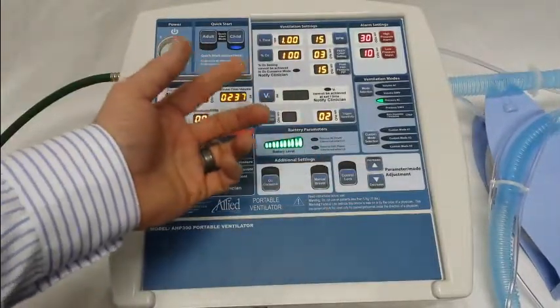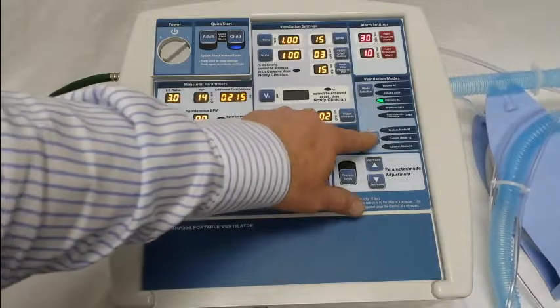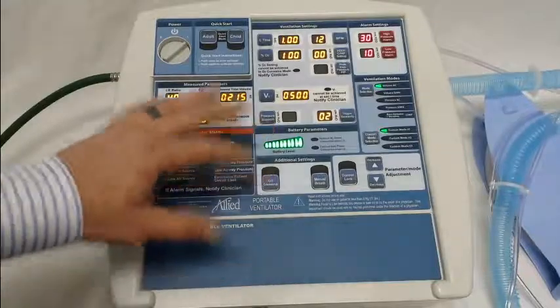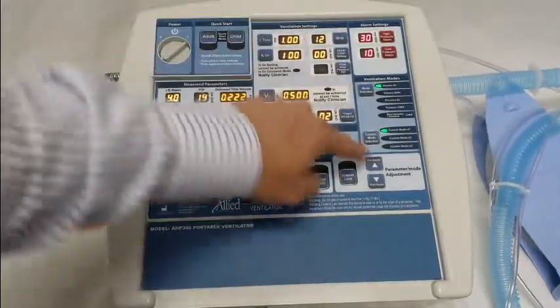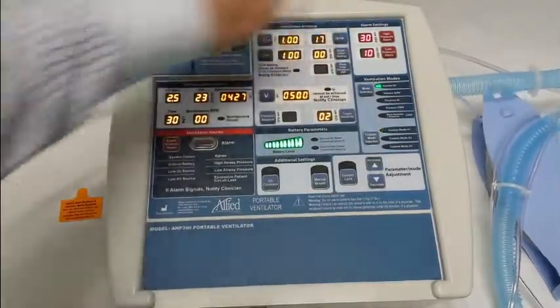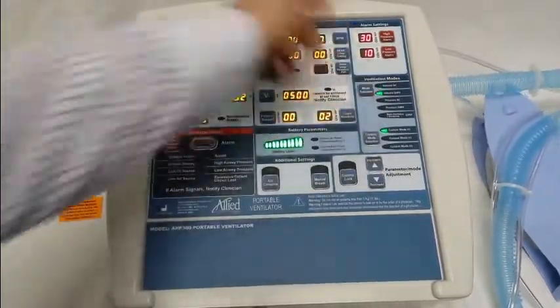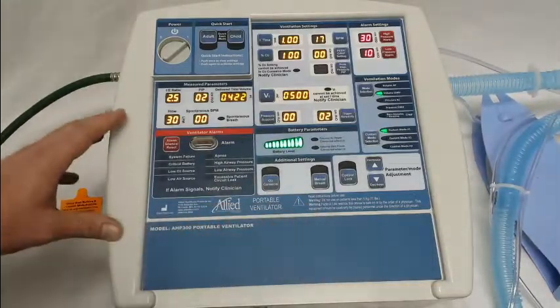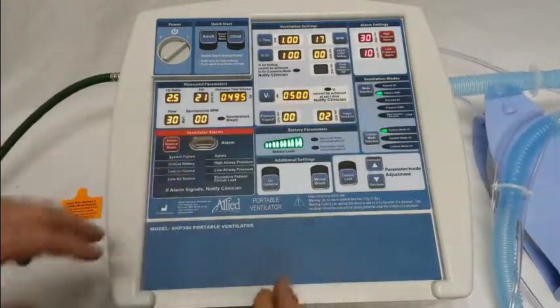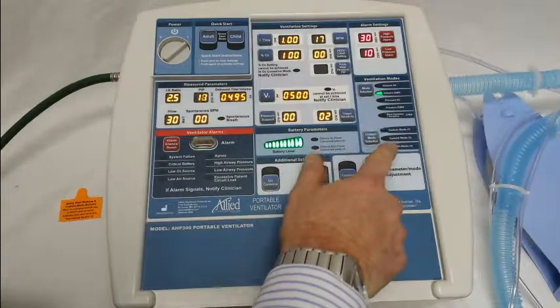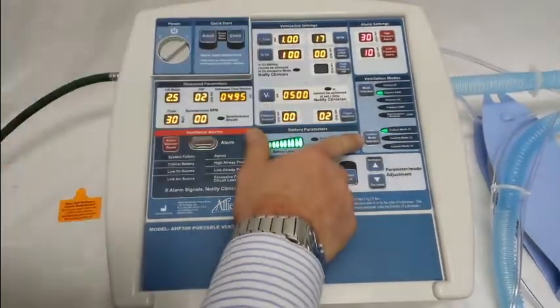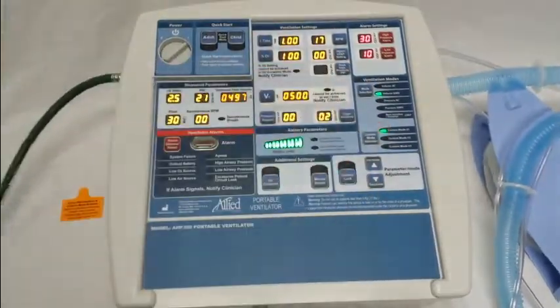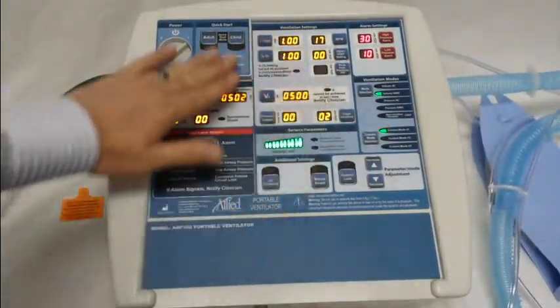If you want to go in and program a custom mode, hold this button down. When you hear a double beep, let go. Then just make whatever changes you'd like — let's say higher breaths per minute, maybe take it to volume SIMV, whatever settings you'd like to save. When you're ready to save it, for the custom modes you simply hold down the custom mode button and press the mode selection button. Custom mode one is now saved under these ventilation parameters.